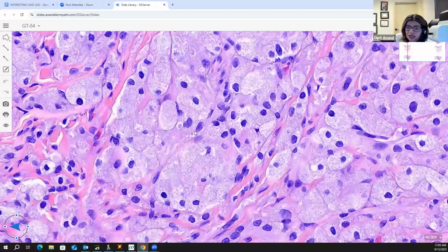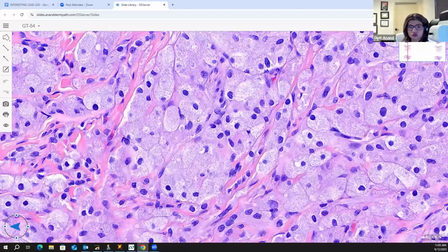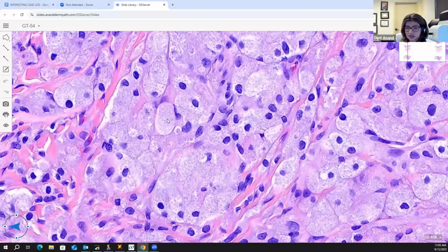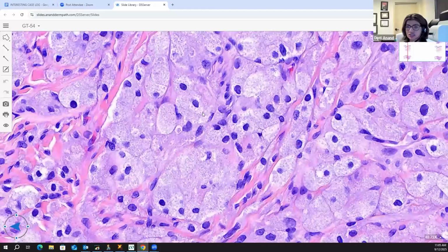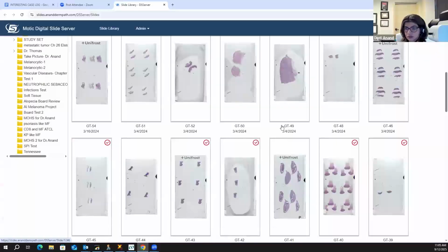So when you look at big cells with pink cytoplasm or foamy cytoplasm, you need to look into it. What does it contain? Does it contain just foaminess, which is lipid, which could be xanthoma? Or does it contain pink cytoplasm, which could be in the xanthogranuloma, reticulohistiocytoma category? Does it contain granularity? Is it a granular cell tumor? Or another example that I'm going to give you, which is a nice mimicker, even though it is a granulomatous process, but an infectious process: lepromatous leprosy.